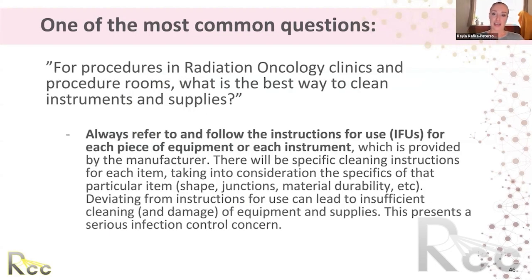Another most common question I get: what is the best way to clean instruments and supplies? I get asked this question from all over the world, and my answer is always going to be the same. We have to follow the instructions for use, or the IFUs, for each piece of equipment or instrument, which is provided by the manufacturer. There will be specific cleaning instructions for each item, taking into consideration the specifics of that item, the shape, the junctions, what it is made out of.